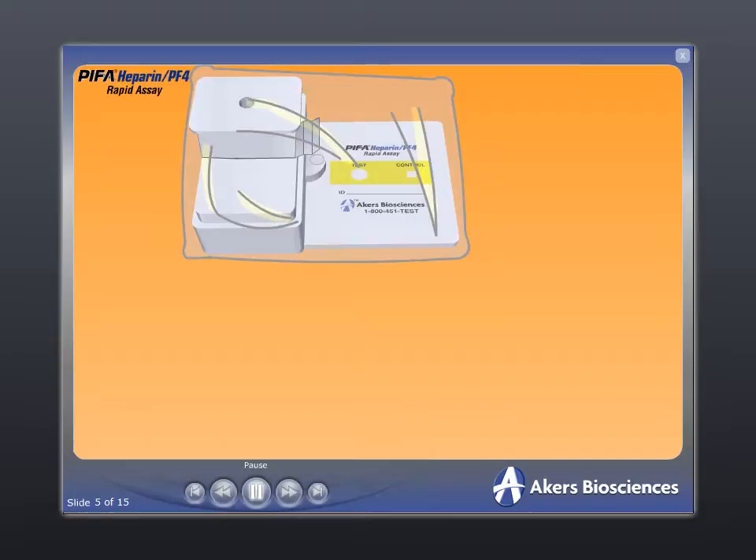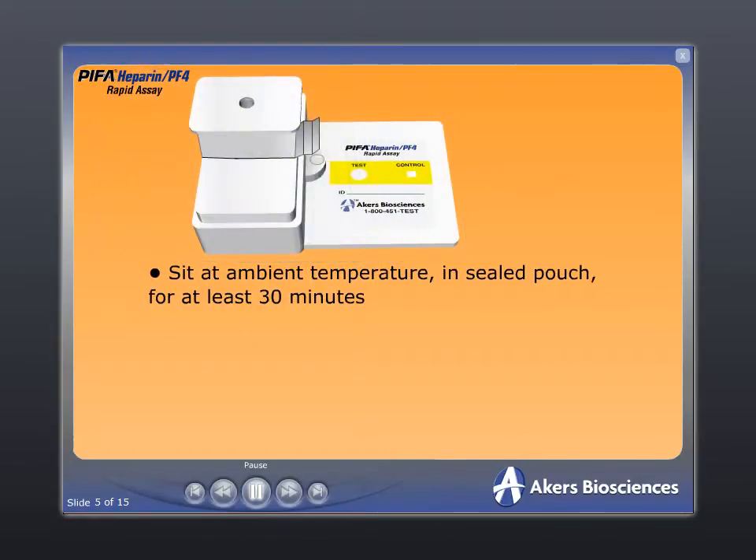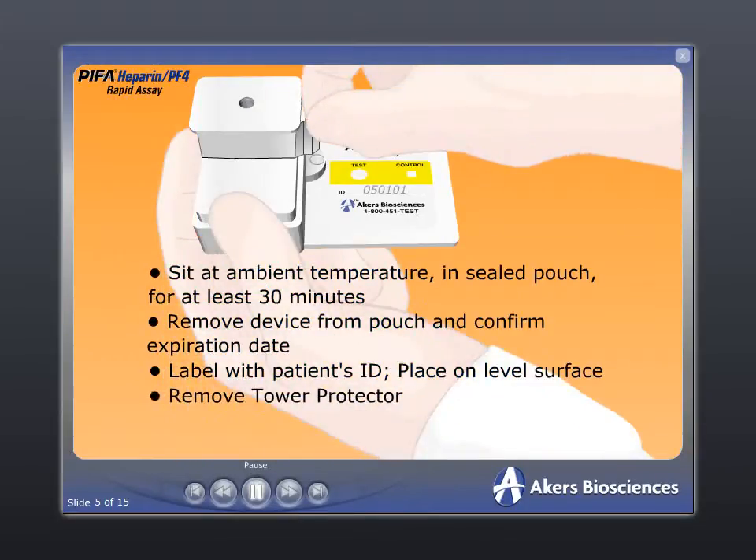Before beginning the test procedures, remove the Pypha Heparin PF4 mini-reactor from refrigeration and allow it to sit at ambient temperature for a minimum of 30 minutes. Visually inspect the device to confirm the date of use is prior to the expiration date. Label the device with the patient's identification and place on a level surface. Remove the tower protector.